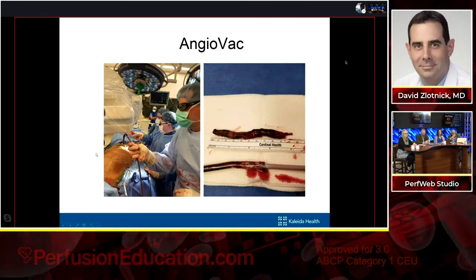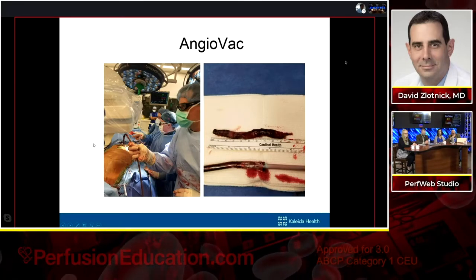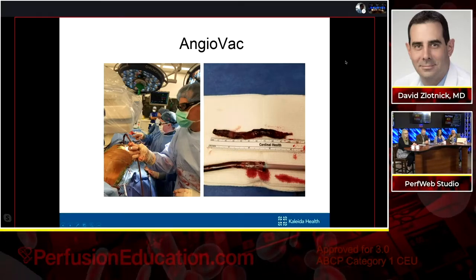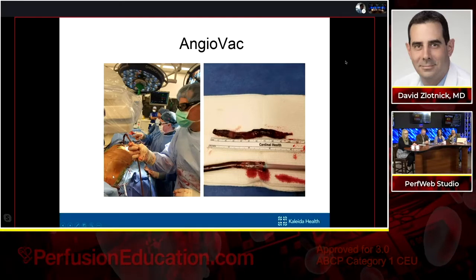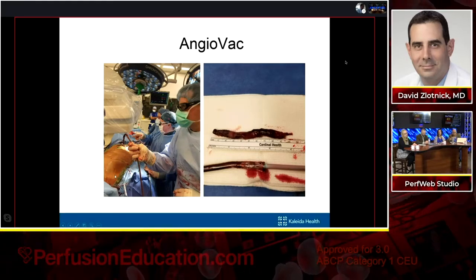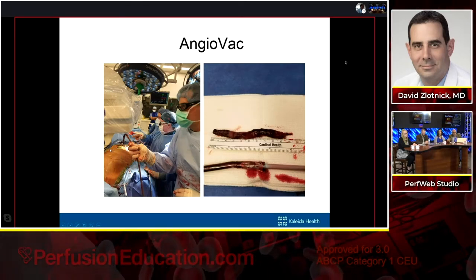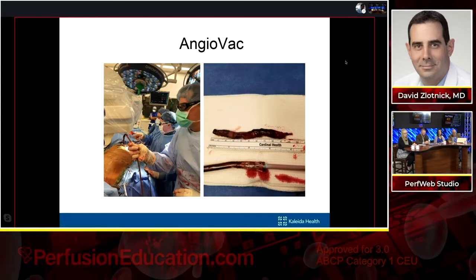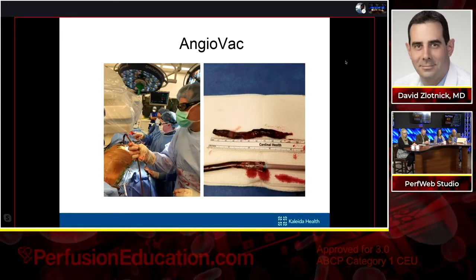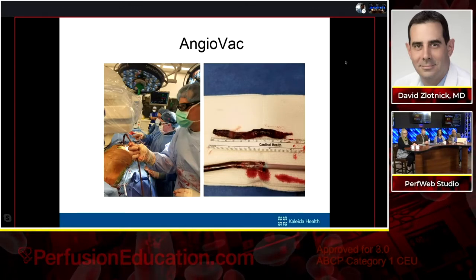So what you don't see is over here on this other side of the table is the surgeon that I work with, as well as my echocardiographer doing surface echo. And when we got in there, we went from an IJ approach. As soon as we went on flows, we lost flow. And so we waited for 2 minutes, let the clot kind of work its way in the cannula. And after 2 minutes, I just started to gently advance my cannula and retract it. And we could see that the clot was moving just on transthoracic with the cannula.